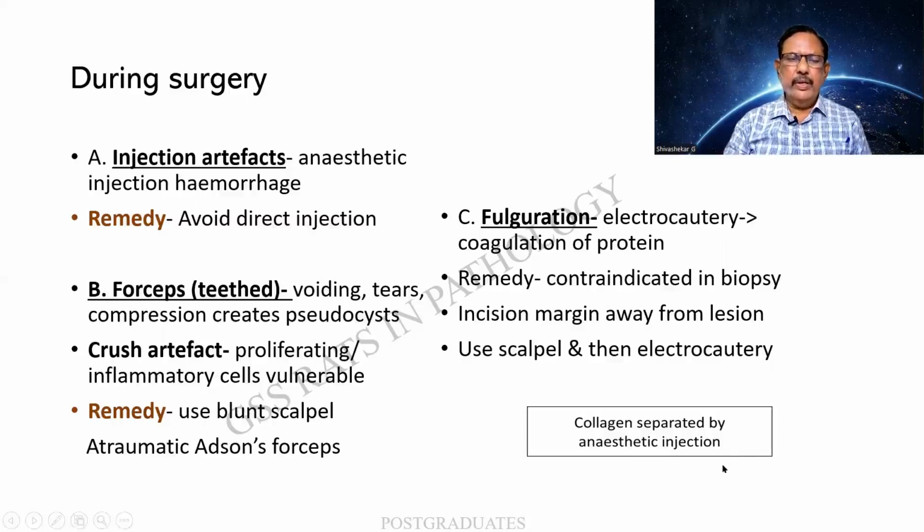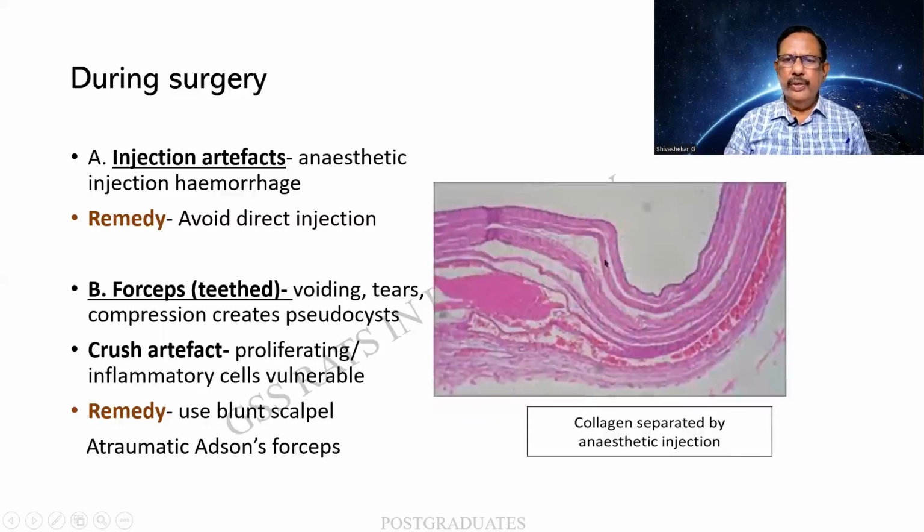Collagen separation can occur due to anesthetic injection. Look at this over here. The bundles are being separated. Nothing wrong in the tissue per se.